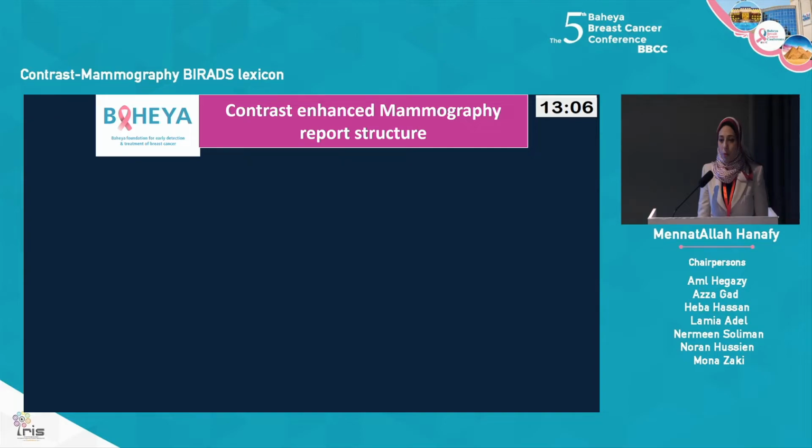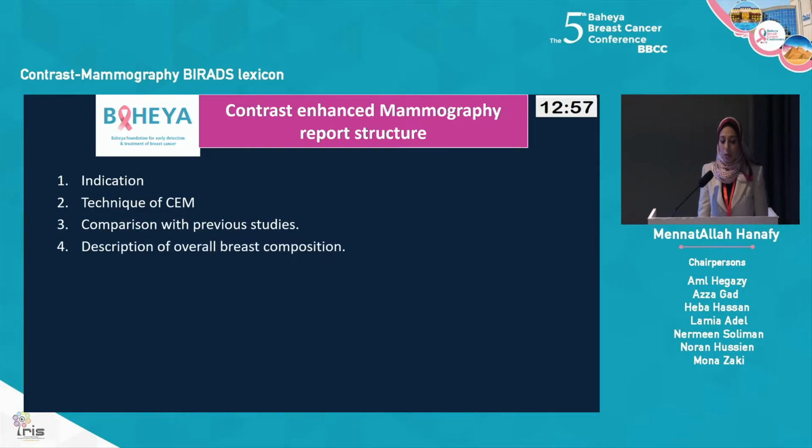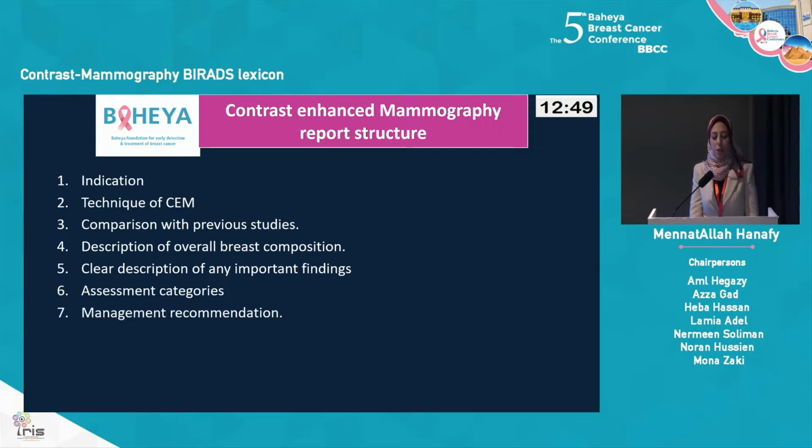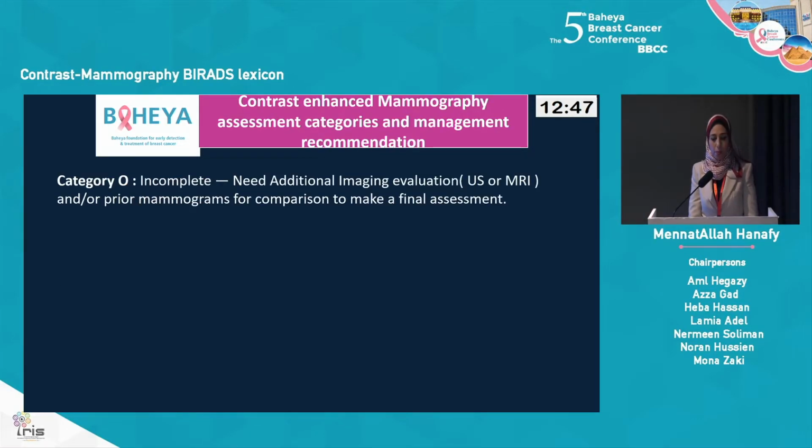The contrast-enhanced mammography report structure should include indication, technique of contrast-enhanced mammography, comparison with previous studies, description of overall breast composition, clear description of any important findings, assessment categories, and finally, management recommendation. Contrast-enhanced mammography assessment categories and management recommendation.